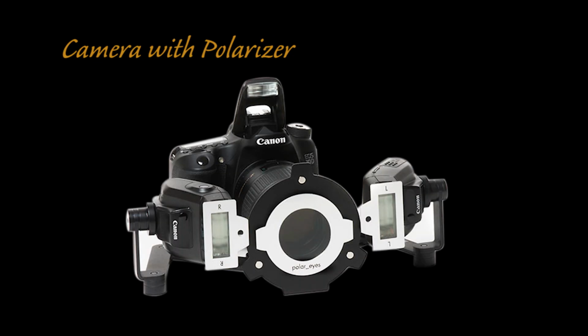So here again, I'm going to reference back to that camera that I showed earlier. So you have the SLR camera. This happens to be a Canon. This is a twin flash, so it's got a flash on either side. It's a little bit more expensive flash. The other ones have just a ring flash that are in dead center. It's one flash all the way around the lens.